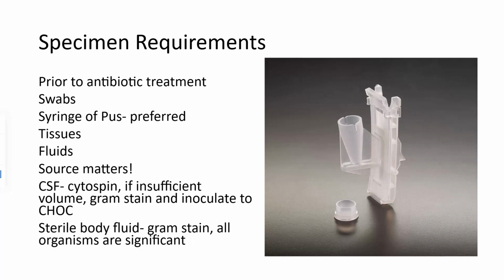Wound and fluid cultures. So specimen requirements, you want to do this prior to any antibiotic treatment. Antibiotics really distort the shape of the cells. So if you're going to do some type of microscopy on them, it's not going to look great. They're not going to grow well on media. So we definitely want to do this before we start antibiotic treatment.